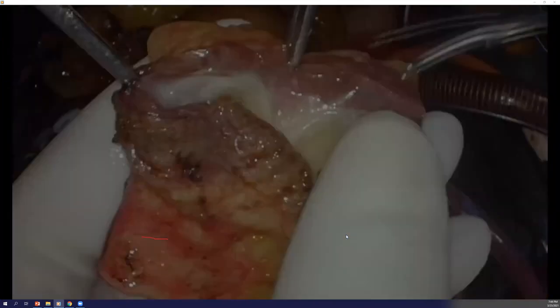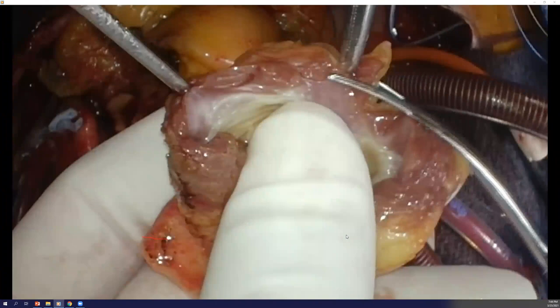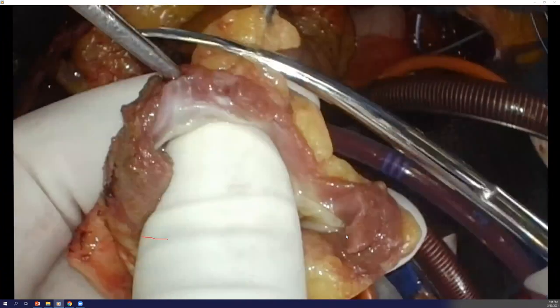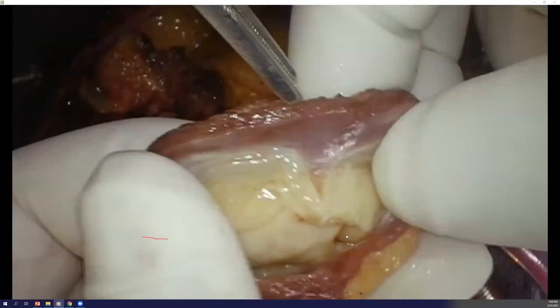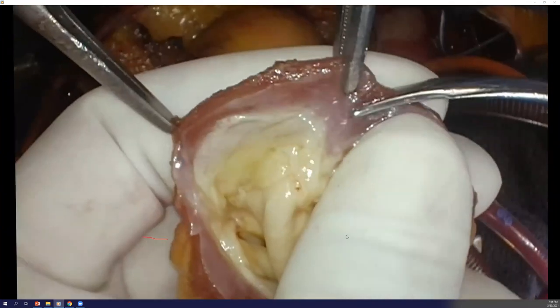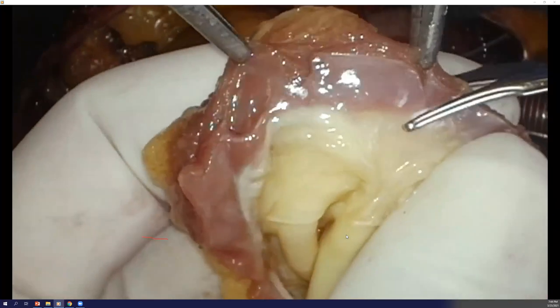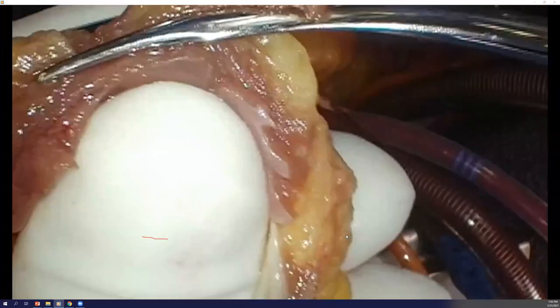This is the trimming portion and slight scalloping under the commissures. So we really want to minimize all of that muscle because this is all dead tissue from now on. Some may ask, well, what about the cusps? How come they don't die? Because aortic and pulmonary valve cusps are not vascularized. They stay alive by diffusion of oxygen from the blood, and that's what keeps them alive.